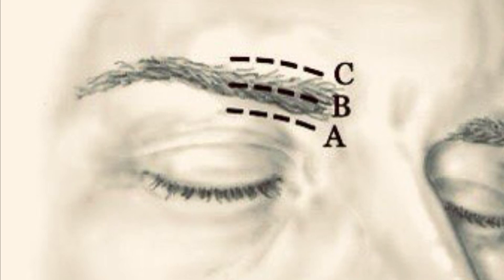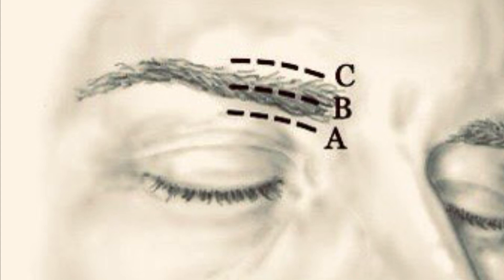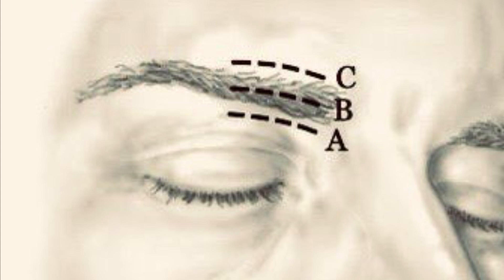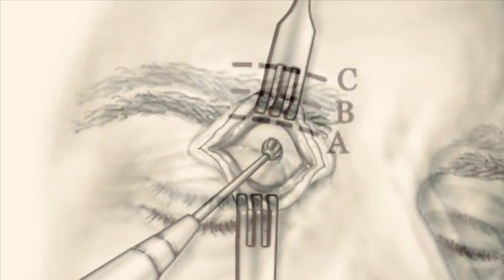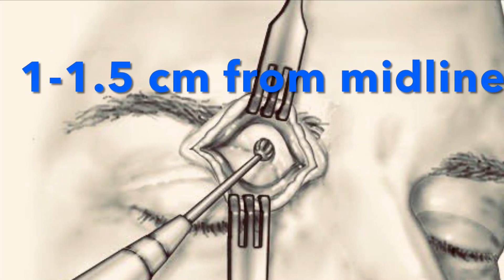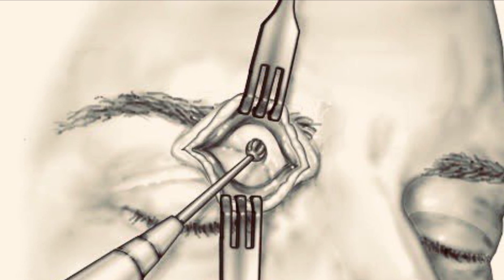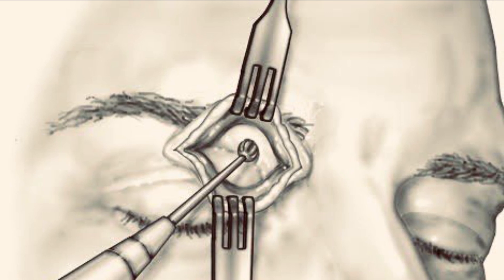Careful dissection exposes the frontal bone while avoiding the supratrochlear and supraorbital neurovascular bundles. Choosing the trephination site is key. Although there's no formal standard, it's generally placed near the sinus floor, about 1 to 1.5 centimeters from the midline, as studies show an increased risk of cross-trephination closer to the midline.